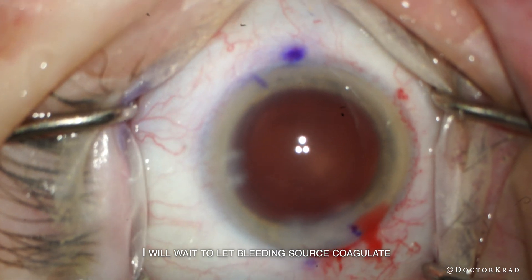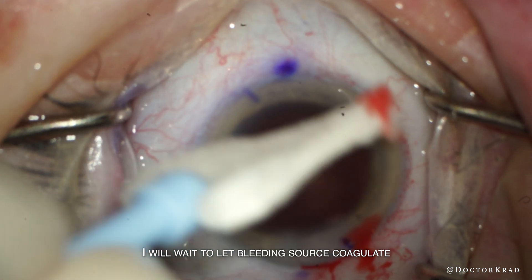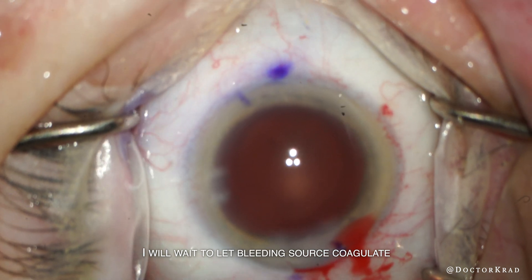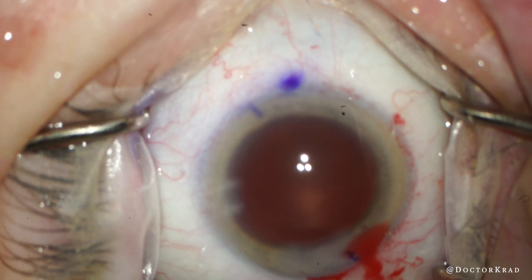If you look at the inferior part of the eye you can see these abnormal blood vessels near the limbus. Other than those limbal blood vessels, is there anything else that you see that can increase the risk of this patient bleeding during surgery?